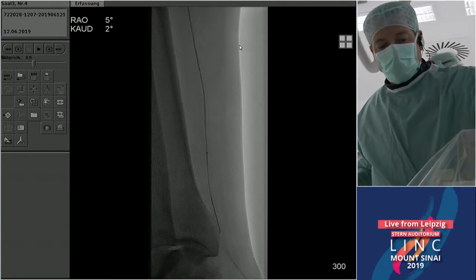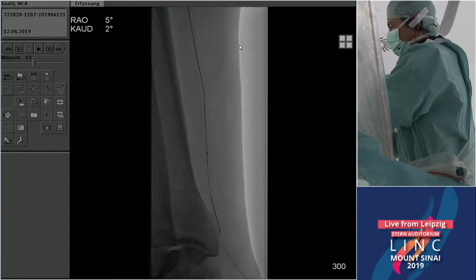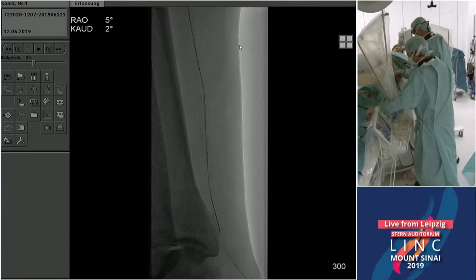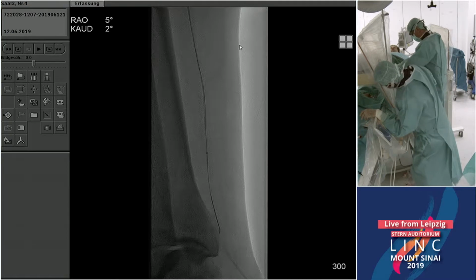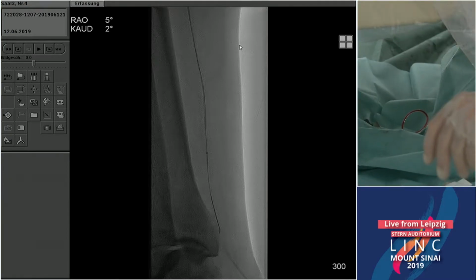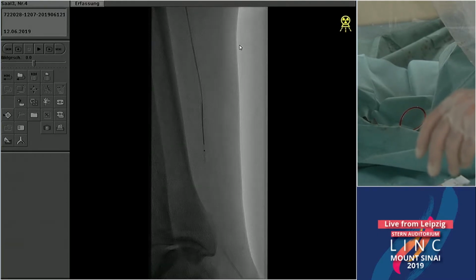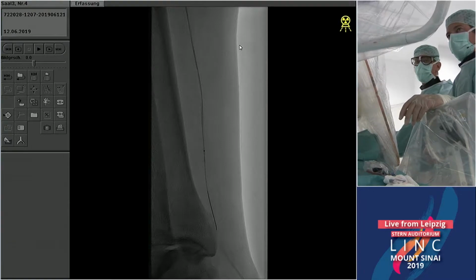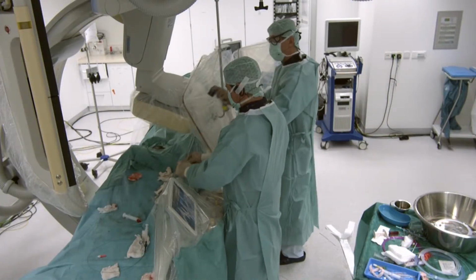Press with the finger. Yeah, it will take us some time now to prepare the artery with our balloons. Not sure. Can we maybe show a little bit more later? Yeah, it's a good suggestion, sure. I think we have a few more talks. Probably do maybe two talks and come back. Is that enough time for you? So, Andre, we are back.